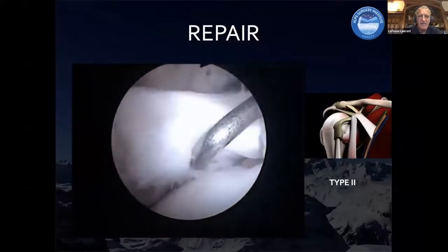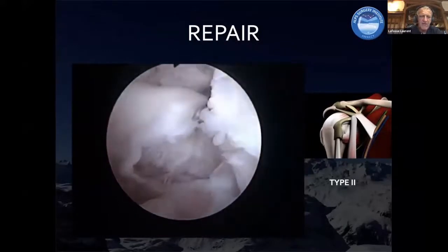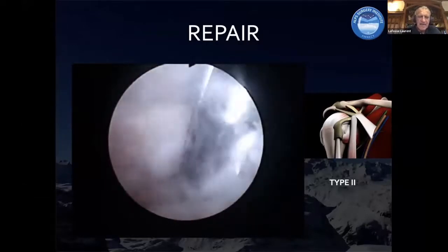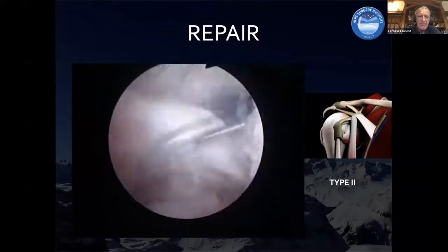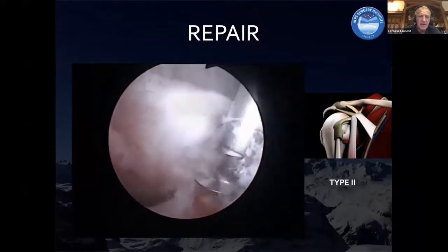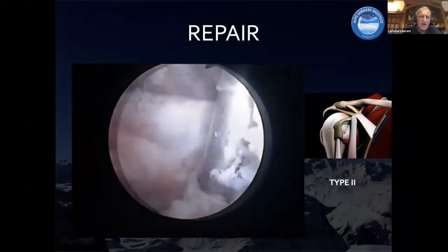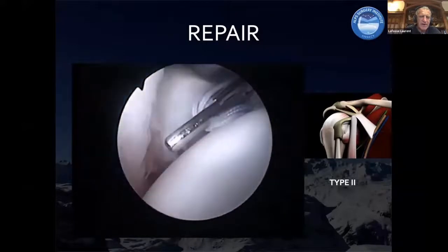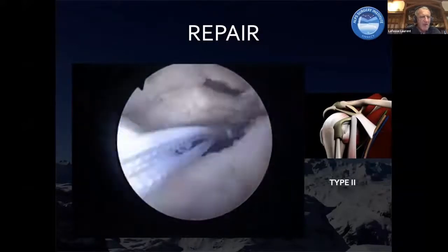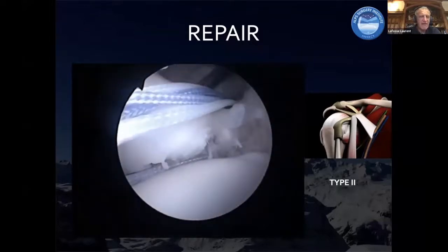So let's have a look first at this one, with the subscap tear at the upper third. This is certainly one of the most common. I must say that now I'm really paying attention not to over-repair this subscap tear. It's important to see where the deep layer is and to bring the deep layer back here. Very often these patients you operate on are stiff post-op and they have pain.